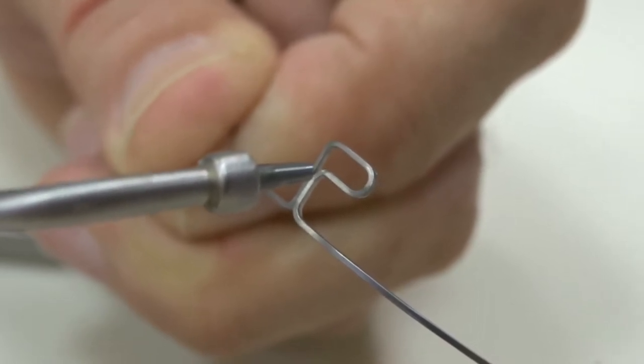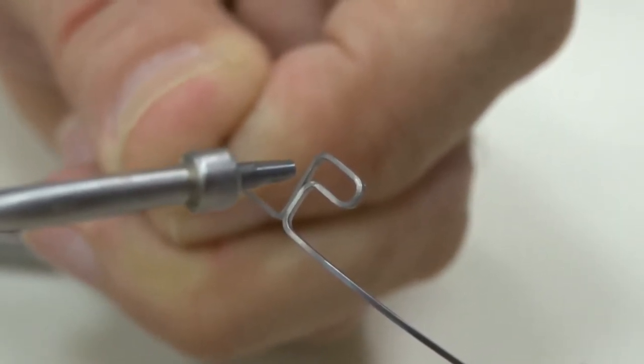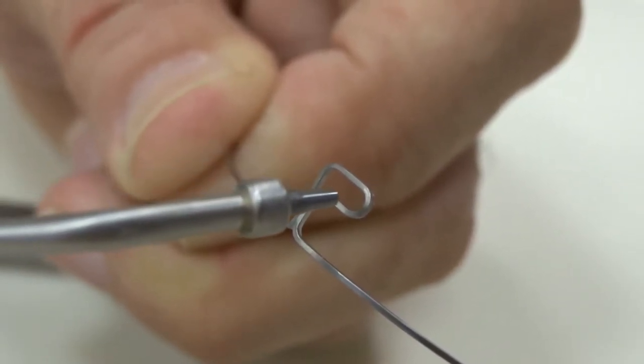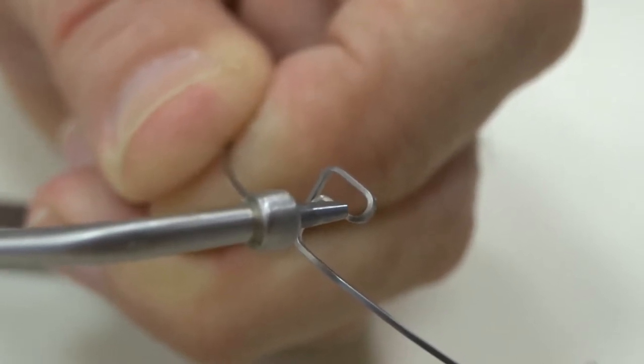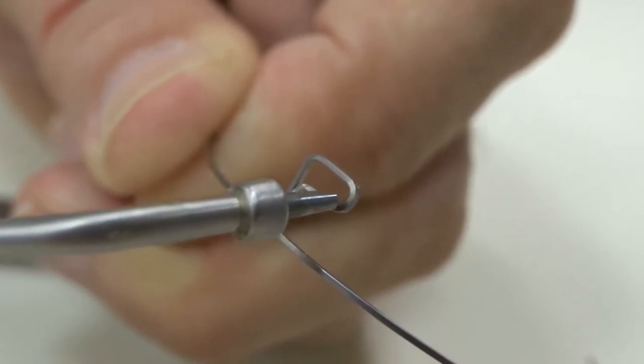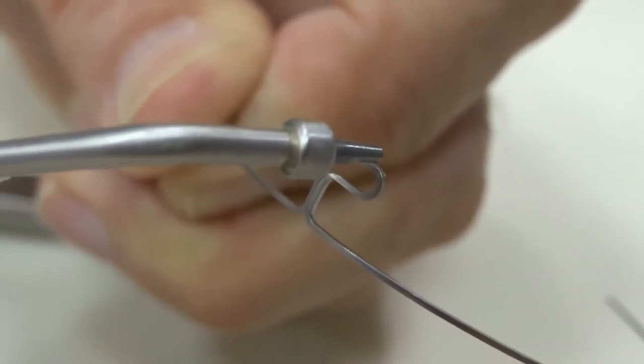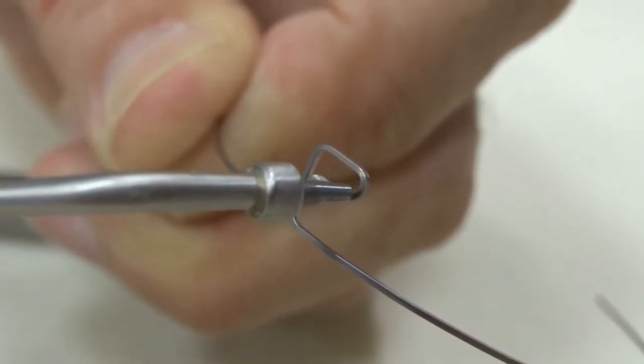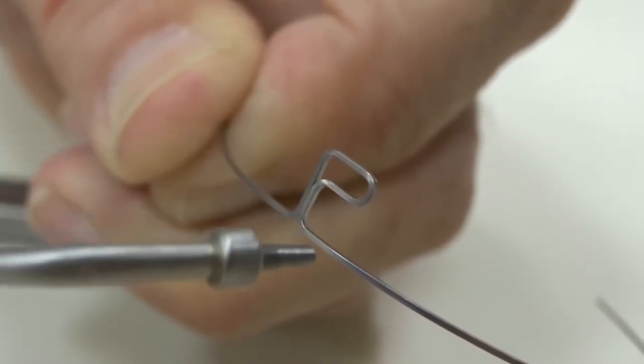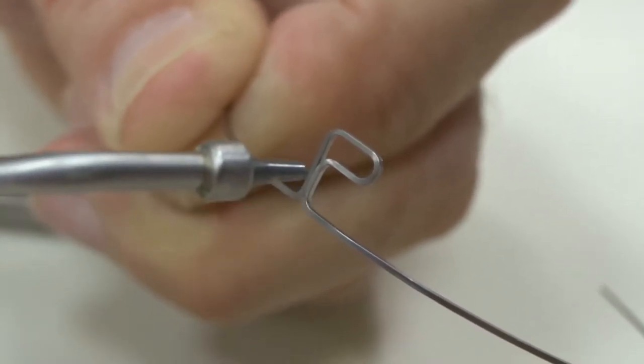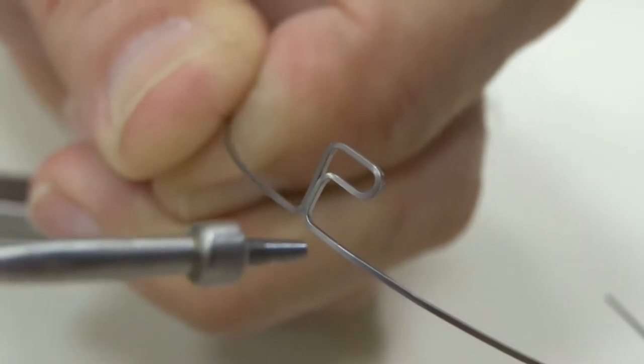If, for example, we wanted to make a step-down in torque, intra-orally I could place a Weingart at this angle or I could place it at this angle and squeeze. That would allow this anterior portion of the wire to step down and torque.